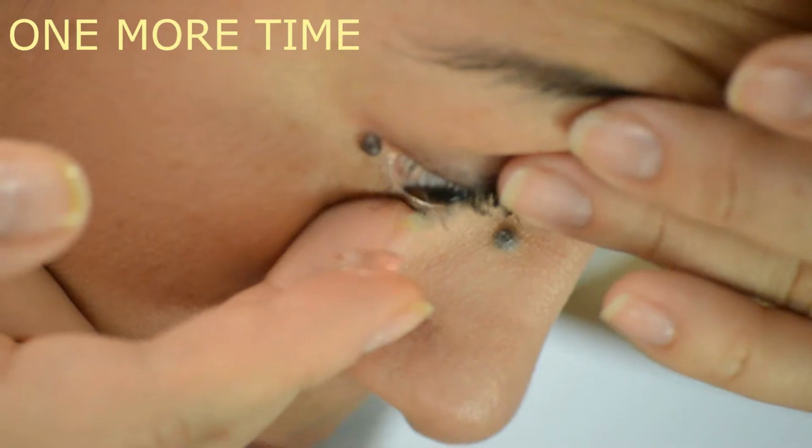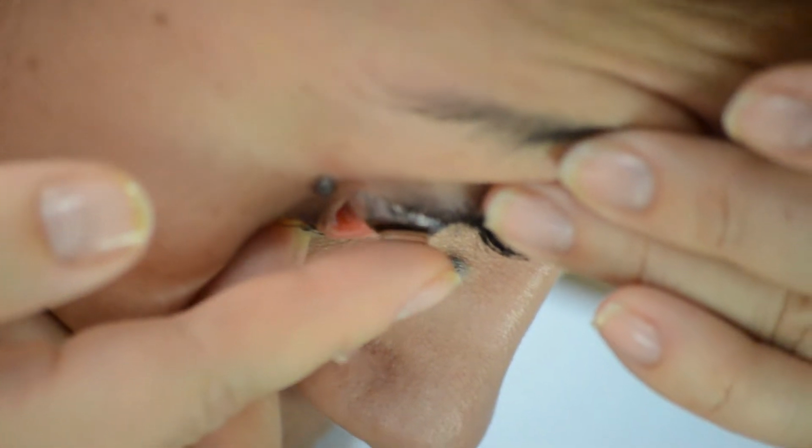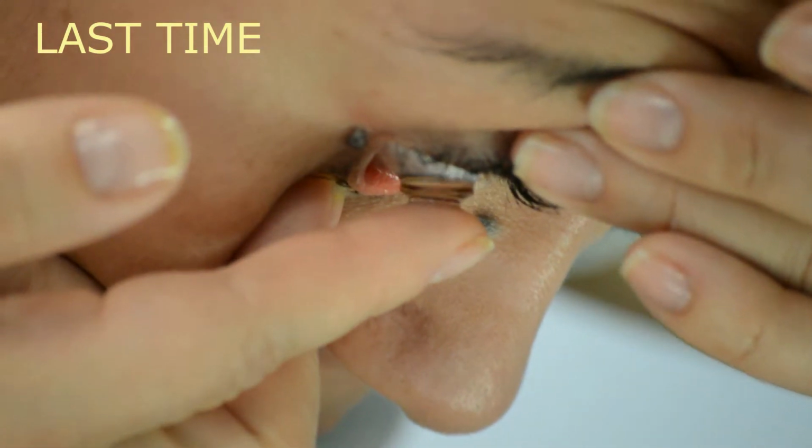Let me show you one more time. Hold your lids wide open and place the lens at the center. Let's do it one last time. Hold your lids wide open and insert at the center.